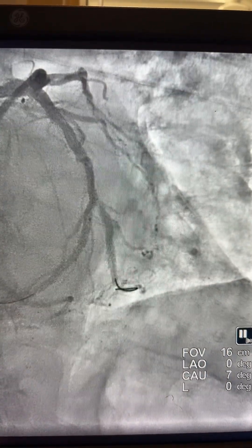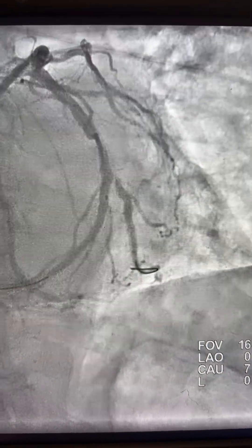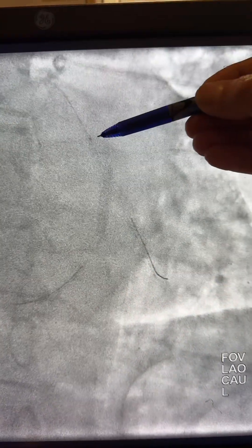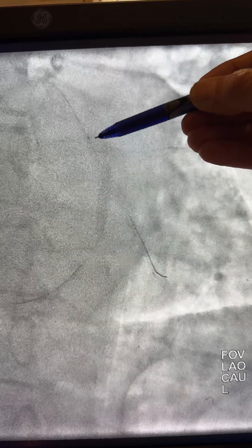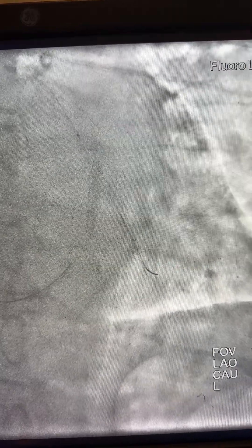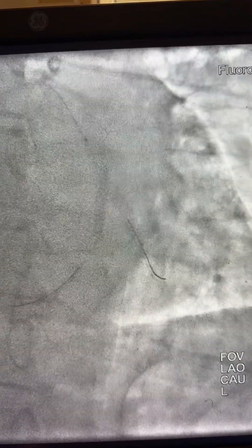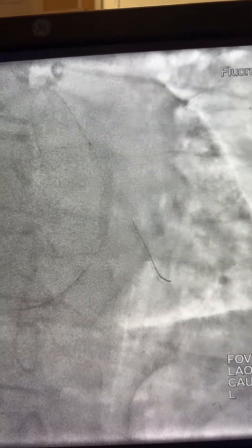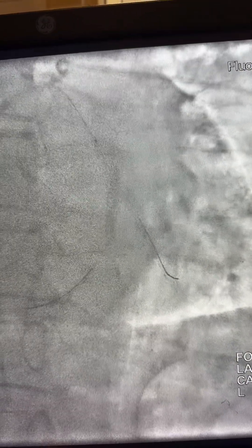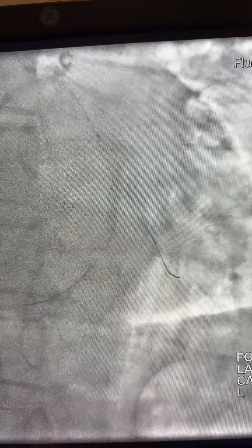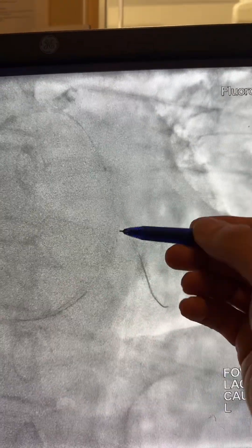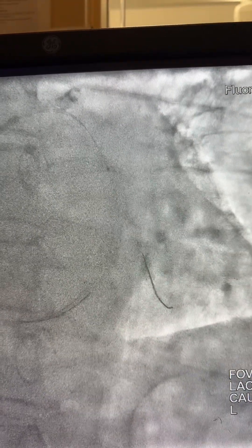The small balloon won't go through the ostial OM. Probably I should have dilated it more before deploying the stent, or kept the balloon there before deploying the stent. Since the small balloon is not going through, we're going to pull it, advance it toward the circumflex, and try another route with the wire.